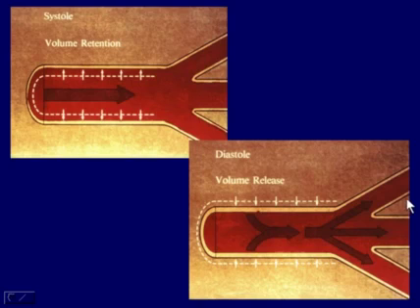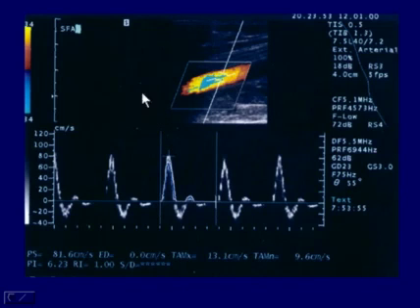down the vascular tree. So when we see a blood flow sample from a peripheral artery, we can see here that we have a nice sharp upstroke in systole, a narrow peak, a rapid deceleration. This below the baseline is the reflected wave. That's the blood going down the vascular tree, hitting the high resistance arterioles and getting kicked back or reflected back. And this antegrade flow that we usually see in many patients is the result of that little bit of blood held out against the walls of the vessel, and when the vessel recoils in diastole, it sends that blood on down south.